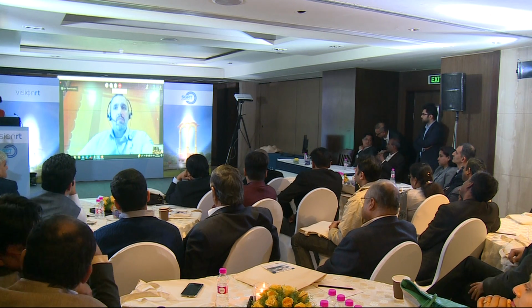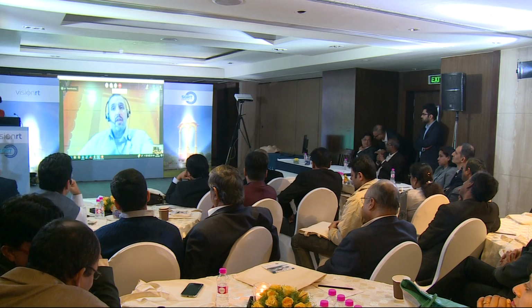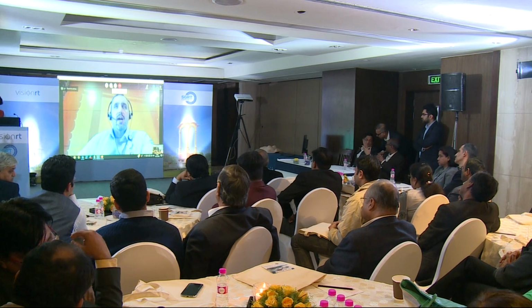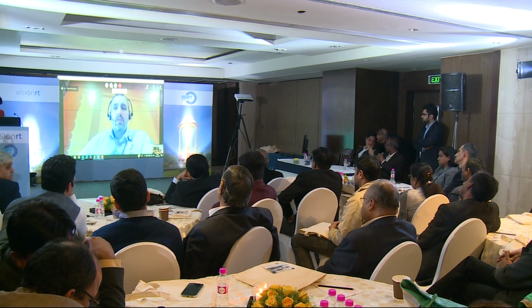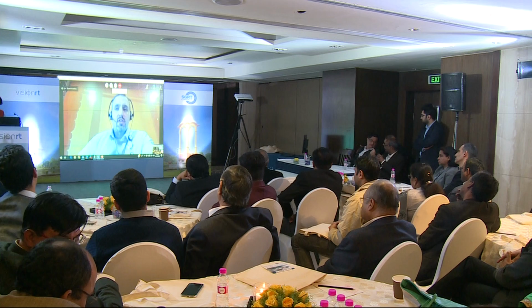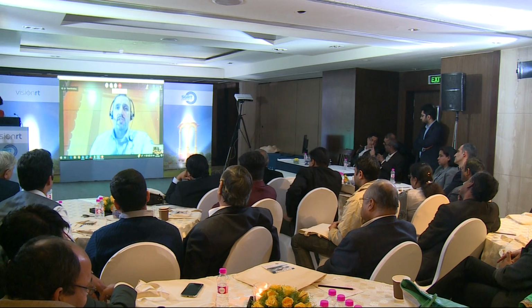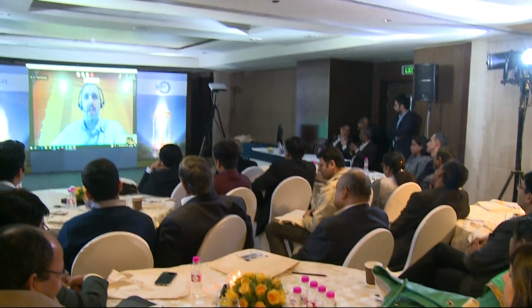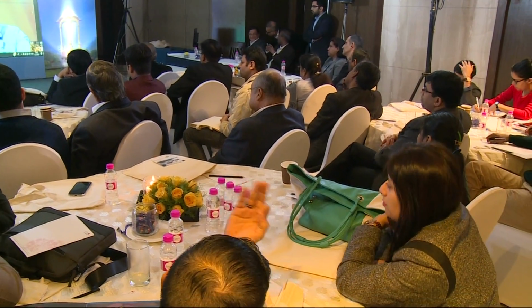And in fact, most SGRT systems will say that the standard ground truth is always IGRT. While it is the ground truth, I don't believe it is the standalone way of positioning patients. SGRT is addressing those limitations that IGRT has, whereas IGRT addresses some of the limitations that SGRT has. So I think they're very complementing technologies, and I don't think one will ever replace the other.